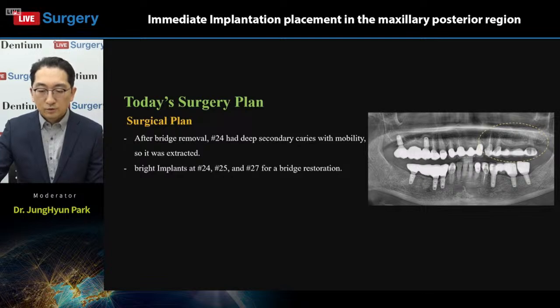After removing the bridge and evaluating, we found deep root caries and severe mobility of the first premolar, so we decided to extract the tooth.